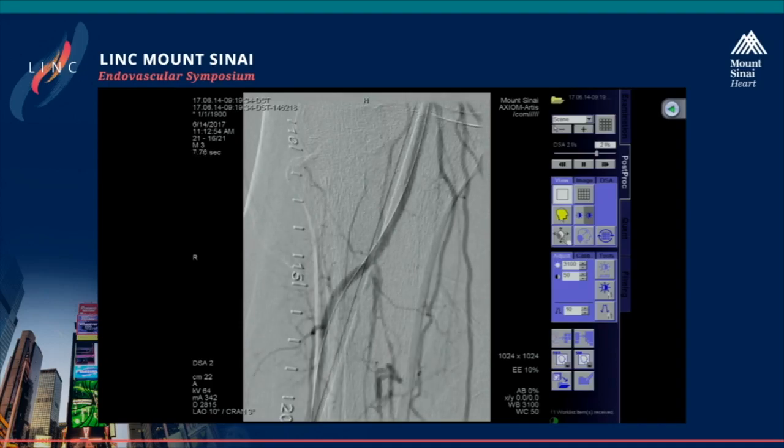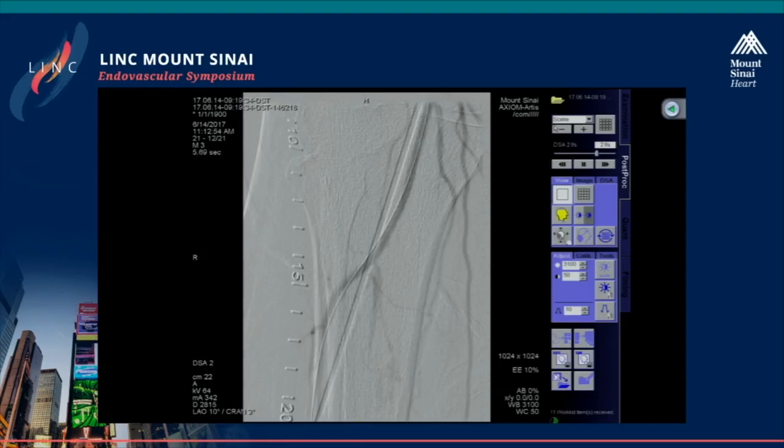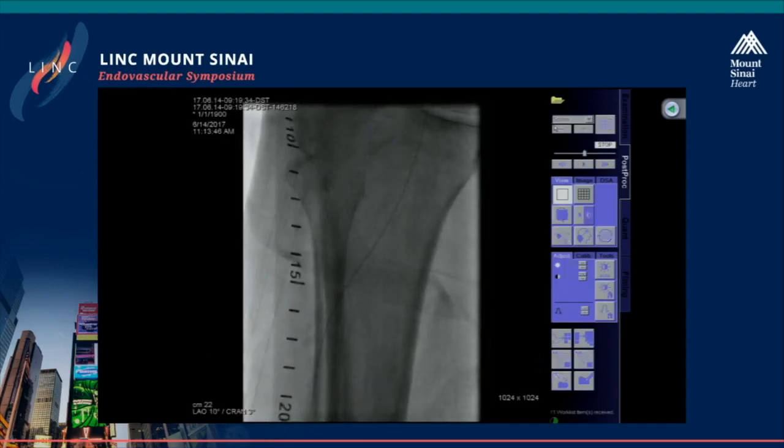But can we see first the distal part to the foot, how the flow there is? Sure. I have the impression that you should maybe also treat the origin of the truncus, because they have a very tight stenosis there. The origin of the dorsalis pedis? Truncus tibiofibularis. Oh, okay. Little dye here? I mean, no dye.